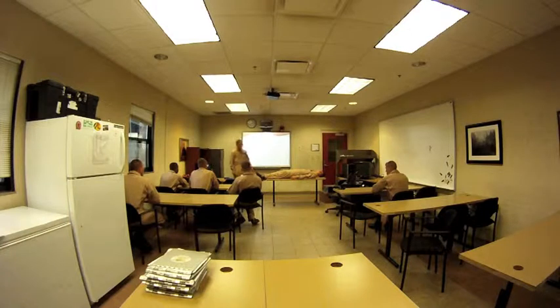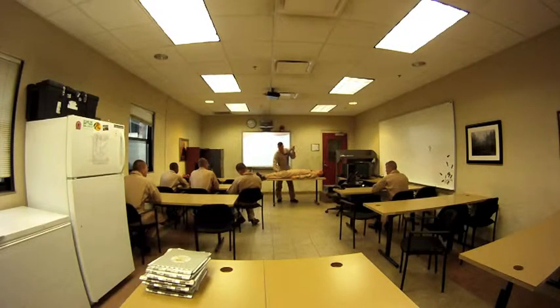All right, step two will be the belt. This belt definitely explains what you're going to be doing. Slip it under the leg at the kneecap where there's a natural void. Seesaw it up as close as you can, as high as you can, and tighten it down. It's nice and tight, like this.